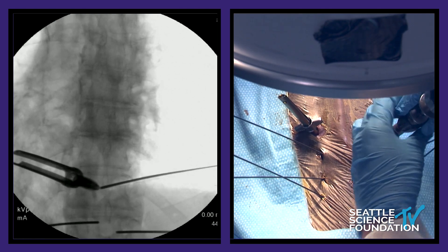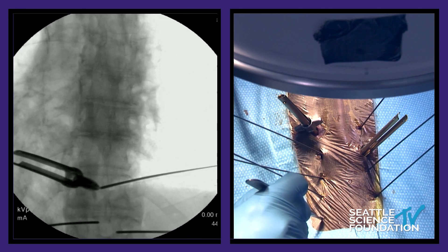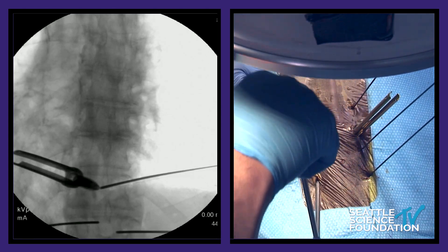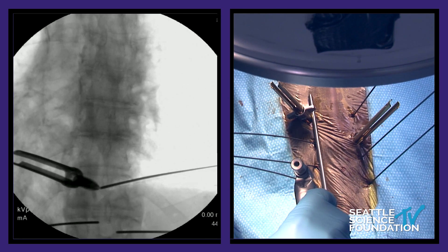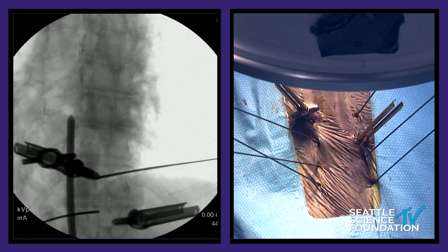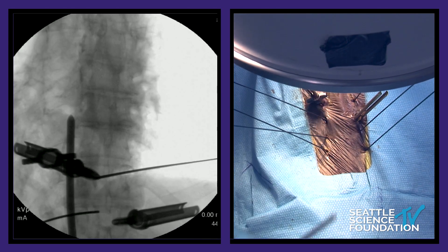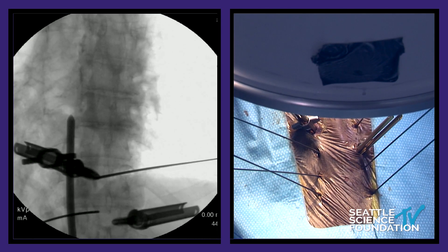We have this nice rod holder and then you can make a stab incision, usually just a little bit below the inferior construct, and then you can just put the rod in just like this. You can kind of guesstimate what that's going to look like. This rod is pretty straight, right Mauricio? So we'll have to bend it a little — put a little bit of lordosis in for the lumbar spine and a little bit of kyphosis in for the thoracic spine. And that's basically it.